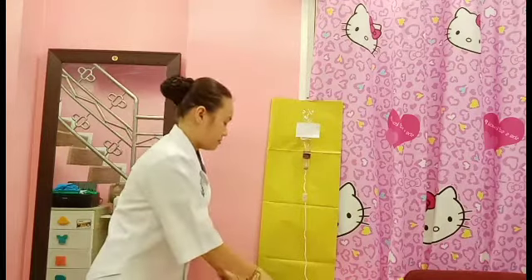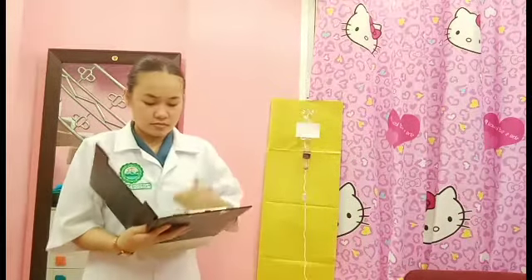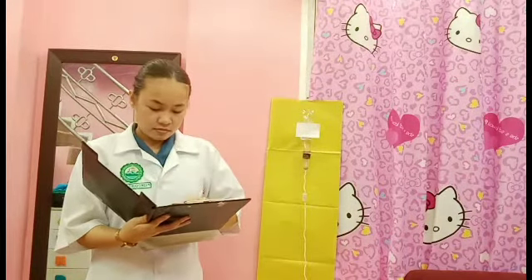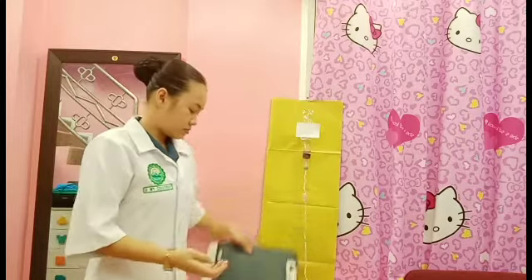And for evaluation, document the procedure and client's response. Chart time, site, device used, and solution. That's all. Thank you.